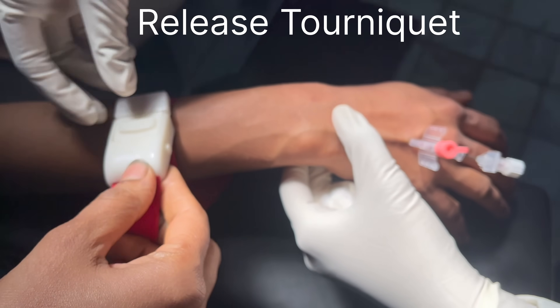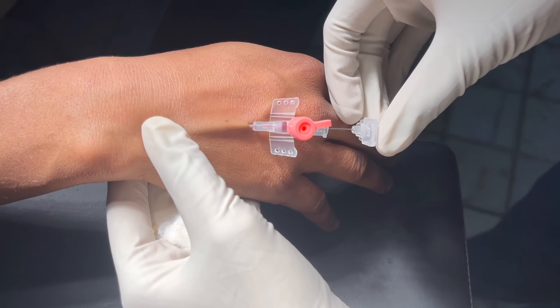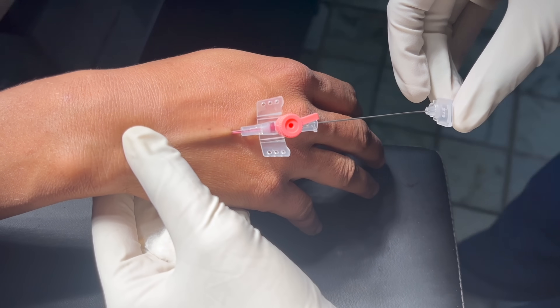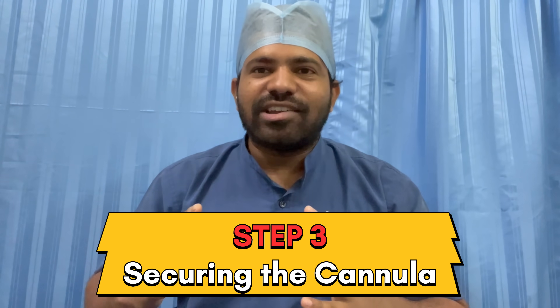Release the tourniquet from the forearm. Apply gentle pressure above the cannula tip with a finger to occlude the vein, then remove the needle. Attach a luer lock cap to the cannula. Step 3 is securing the cannula and testing.